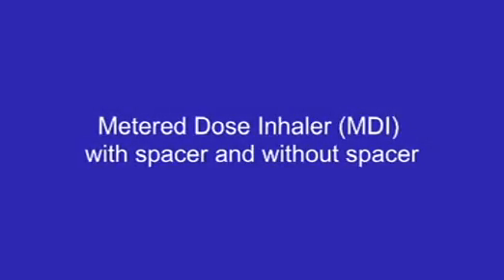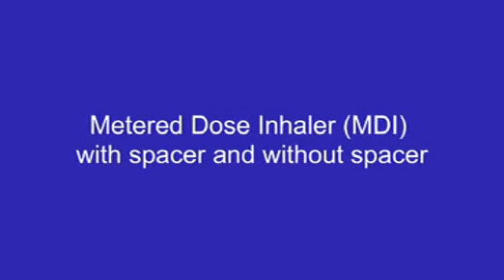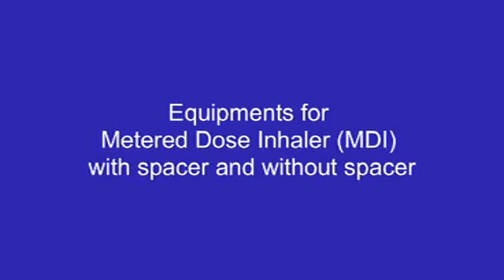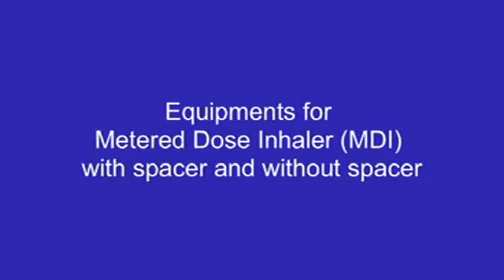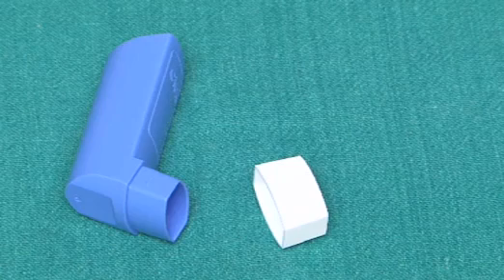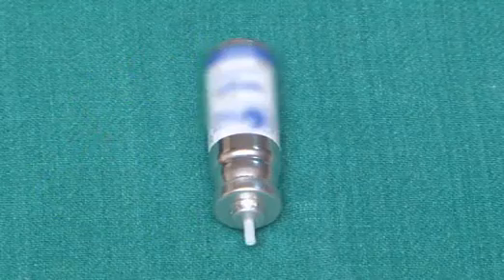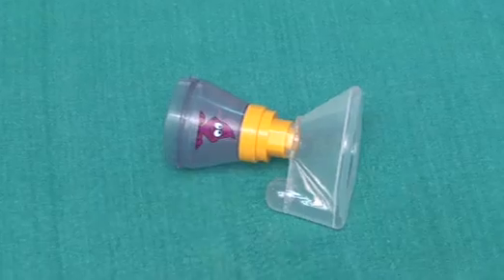Metered dose inhaler (MDI) with spacer and without spacer. Equipments for metered dose inhaler with spacer and without spacer: metered dose inhaler with cap, canister, spacer, face mask.